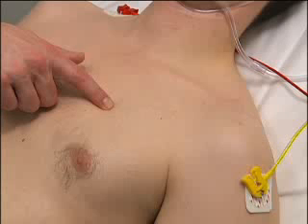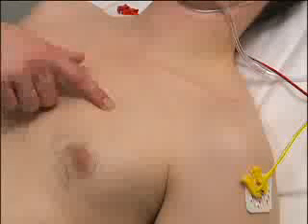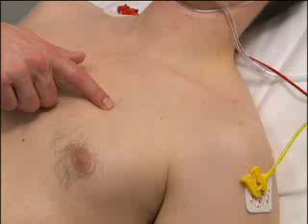Then locate the third rib. The second intercostal space is the area between the second and third ribs. Next, identify the middle of the clavicle and the mid-clavicular line. The intersection of the mid-clavicular line and the second intercostal space is the correct place to insert the needle for aspiration of pneumothorax. It can be helpful to mark the needle insertion site with a skin marking pen.